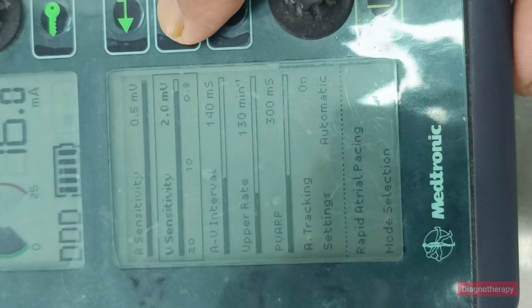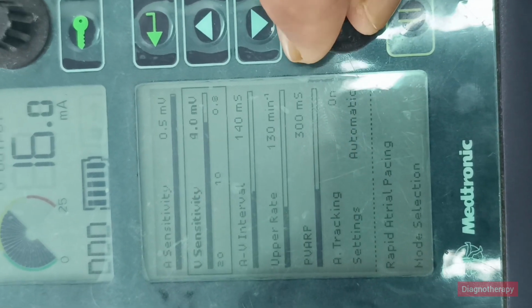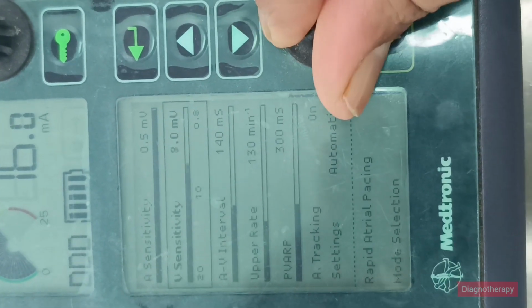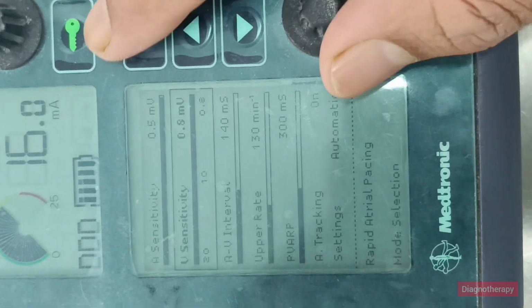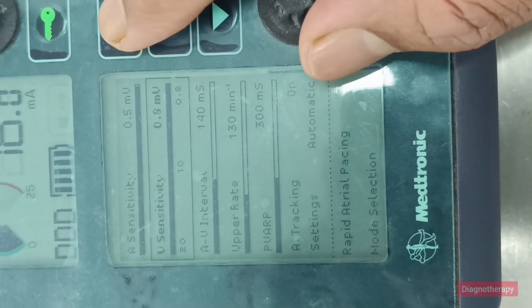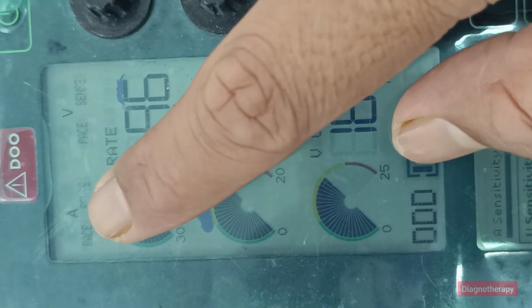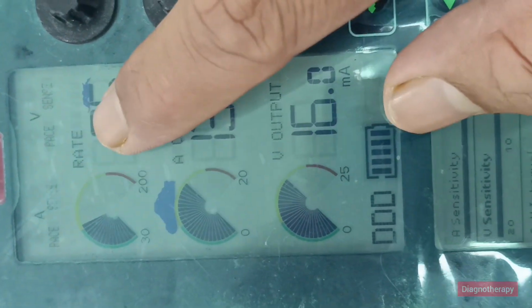And there is a scroll button, a black colored scroll button. With this knob you can change the values. See, the values are changing up, down. You can increase or decrease the values. After setting, you can just press the enter button, and then you can go back to the menu. Here you can see atrial and ventricle values, and this is the rate.